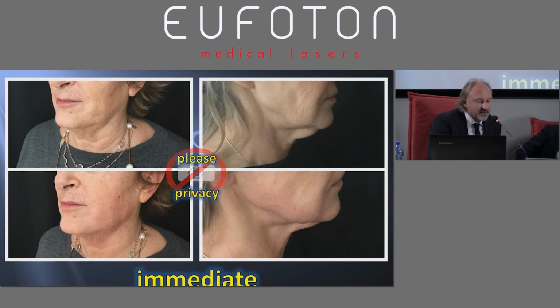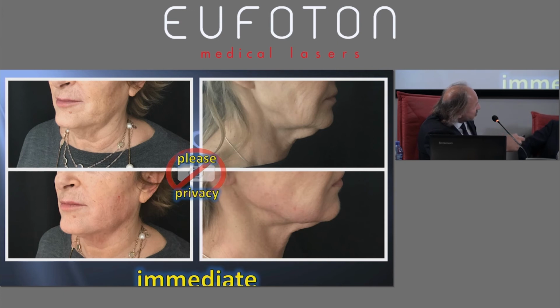I'm showing these photographs to our patients as well, so they know what to expect after the treatment. On the jawline, can you see it? You're a bit too far. Can you see this erythematous area? That's something to expect. Very marked, more diffuse erythema with some more eye-catching marbling. That's the second step we were referring to when I spoke about the yellow light, the traffic light.